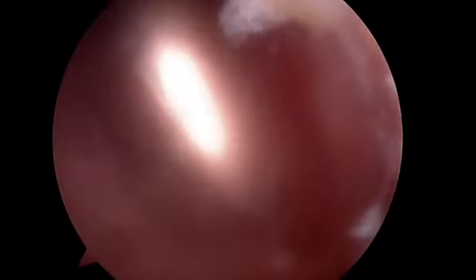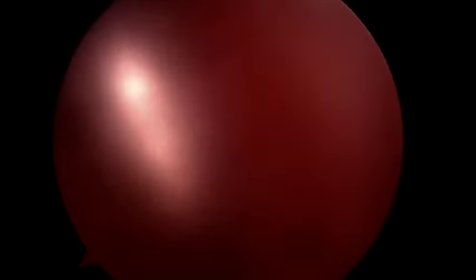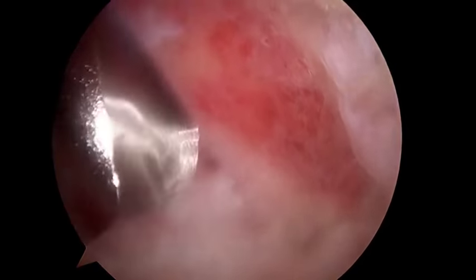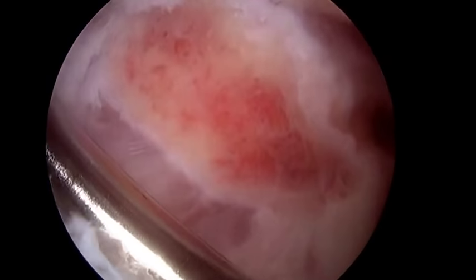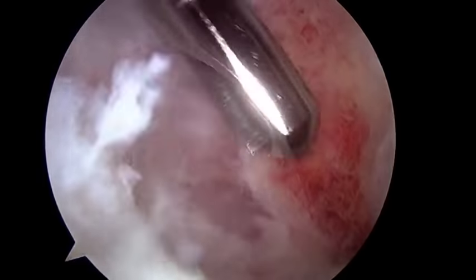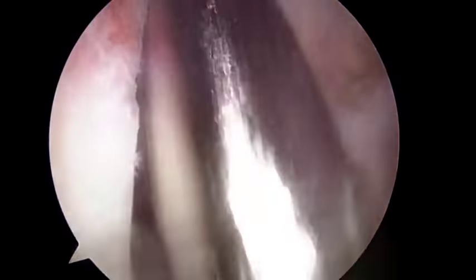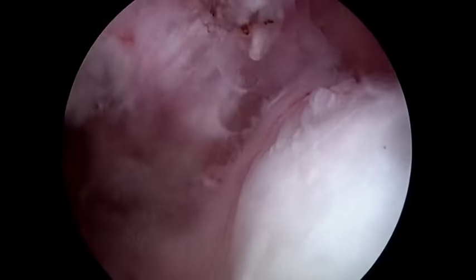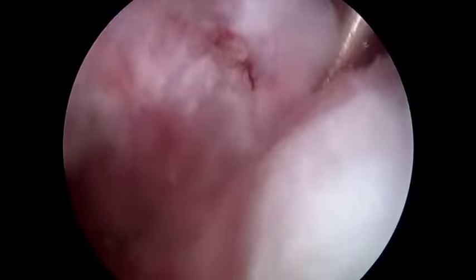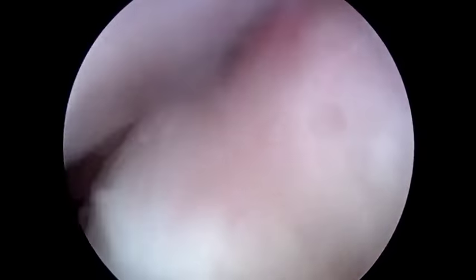This part of the procedure does tend to bleed a little bit, because the bone is where the blood comes from. There's the end of the clavicle, and that's nice and clean. We can see we have plenty of room here. We've cleaned off the undersurface of the acromion, and we still have some residual adhesions here, which we're going to clean up with the shaver. All these bleed, as you can see.